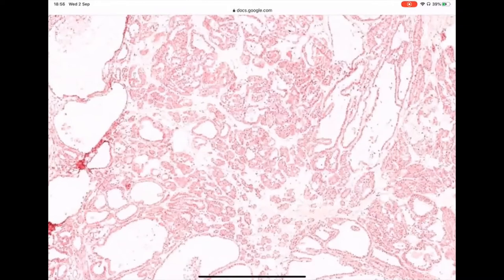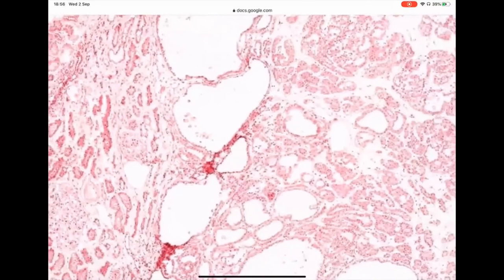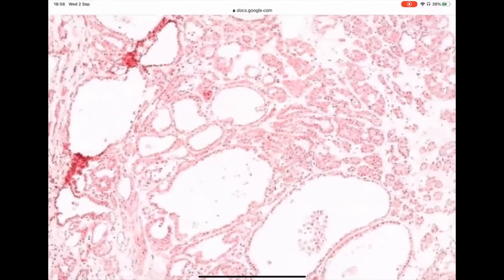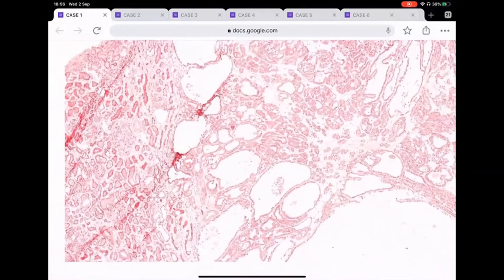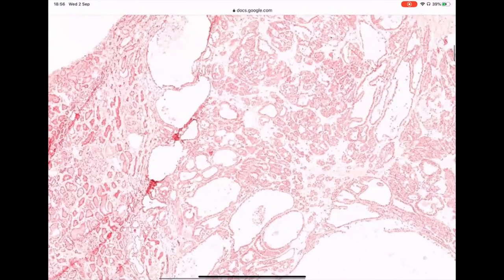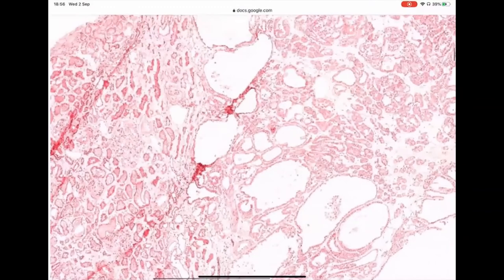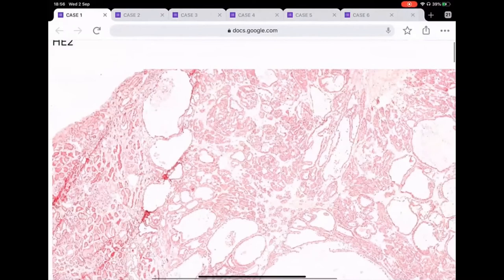And yes, you can see there is a little bit of tubular, and I will stick to the term tubular because that is the term that we are familiar with in the kidney territory. So there is a tubular proliferation. There are some large, some small, and that's all we can say at these magnifications. And we don't see glomeruli. This is another thing that you can spot, maybe one here. Yes, there is one here. You can spot that glomerulus here around this tubule. But in the actual lump here, or these cystically dilated tubules, there are no glomeruli.